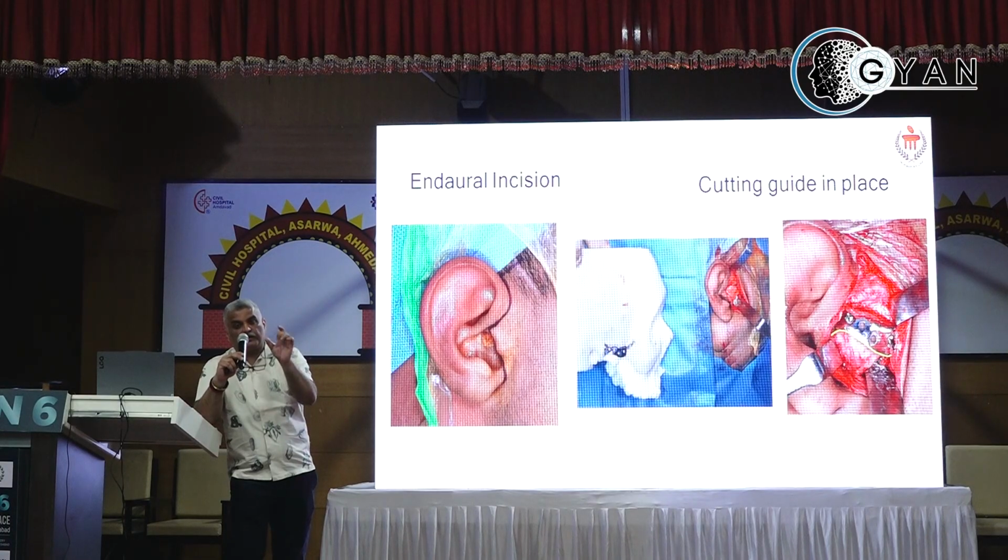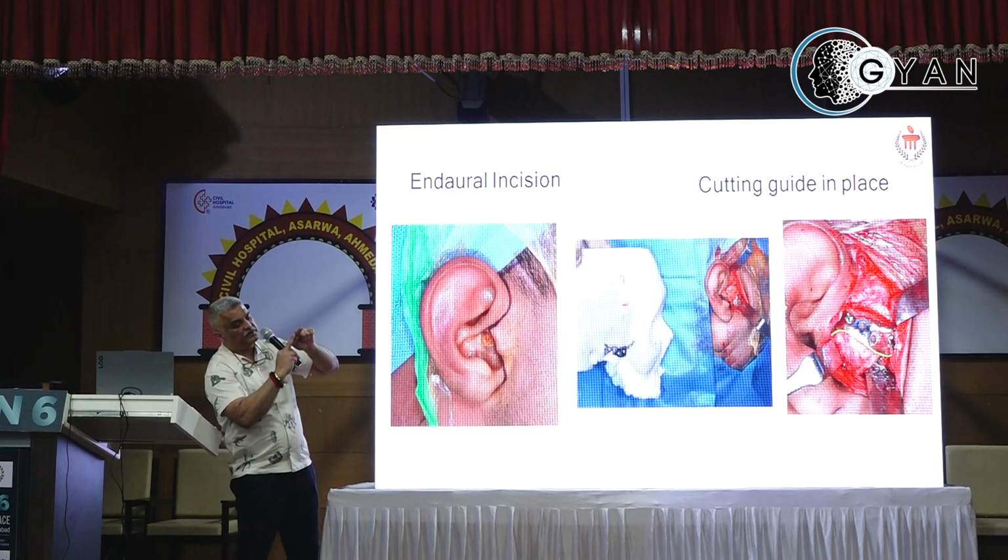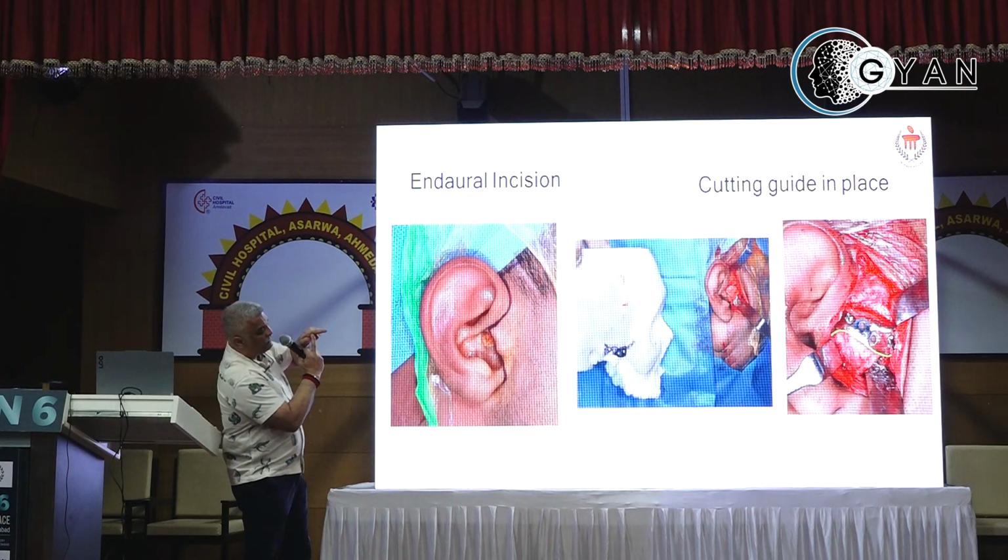Within that 1 centimeter, you place your incision from the root of the arch to the temporalis fascia, a 45-degree approach, as Sonal spoke about, which was promoted by Ed Ellis. There's another approach where instead of placing the 45-degree incision at the temporalis fascia, you place a reverse L incision at the root of the arch. That's a horizontal incision within that 1 centimeter boundary at the level of the tragal cartilage. That's 1 centimeter. And then follow the tragal contour. So it becomes a reverse L.